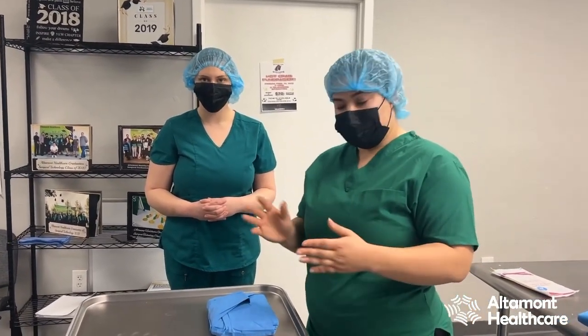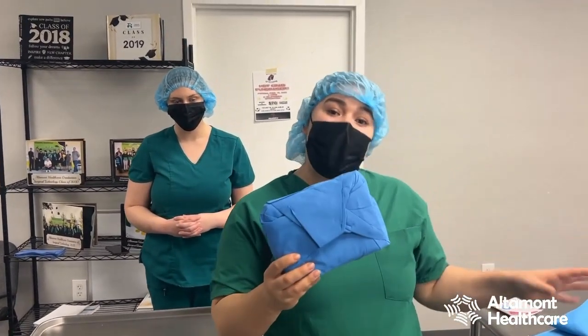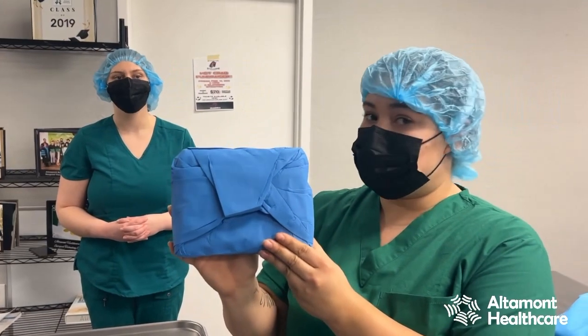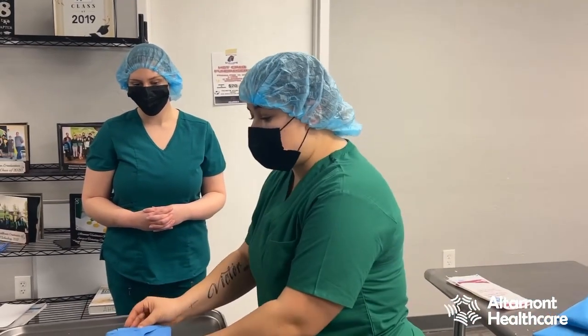The first step to open a gown — it comes like this. It will either come in your pack or it will come alone. This is a gown. The outside of this gown is not sterile, but everything on the inside is sterile. You'll have it on your mayo stand, which is typically where it is preferred to gown and glove.